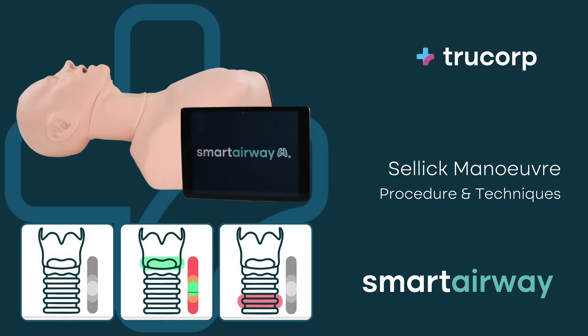Smart Airway will guide you on the proper force, location, and instances of improper technique.